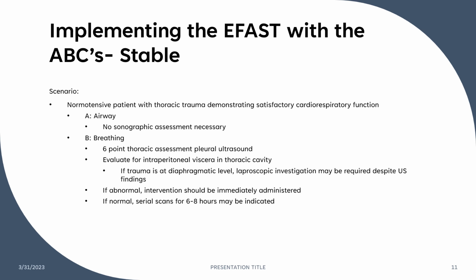So once you have that complete, you can definitely then evaluate the intraperitoneal viscera and the thoracic cavity. If the patient has had trauma at the diaphragmatic level, it might be prudent to go to laparoscopic investigation despite the ultrasound findings. However, that would be your clinical assessment and decision, because sometimes it can be very difficult to detect a diaphragmatic rupture by ultrasound. Not impossible, but definitely challenging.